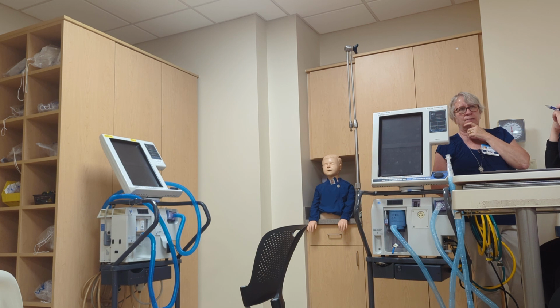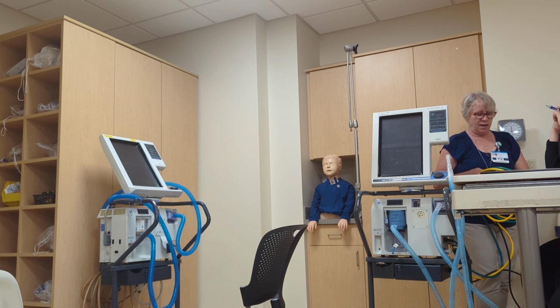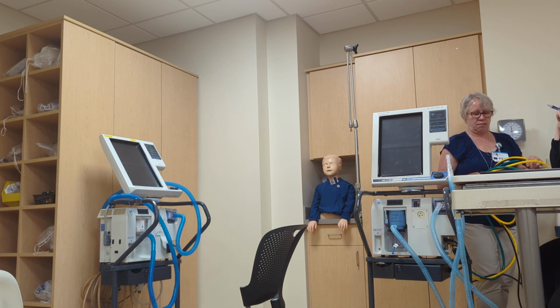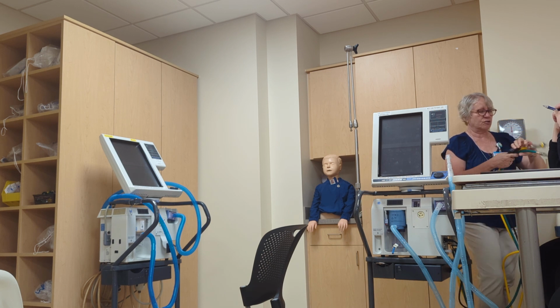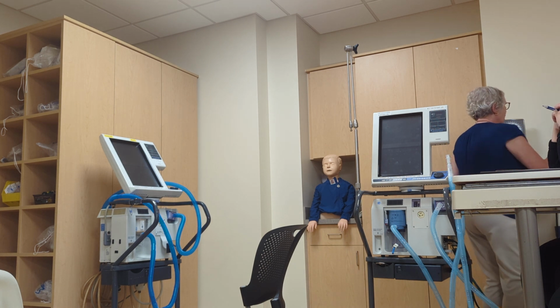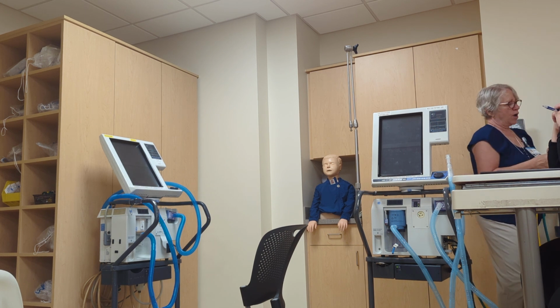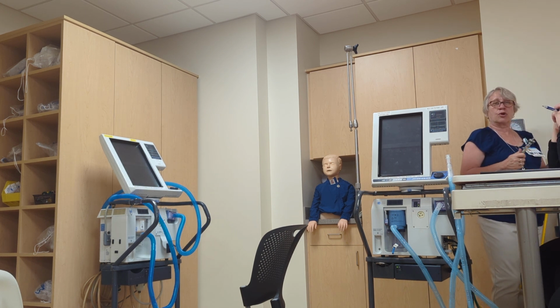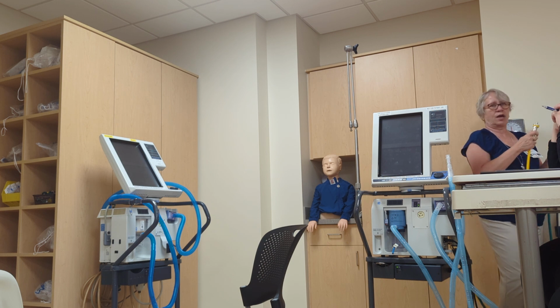Does that make sense? I can turn on my 100% oxygen, which I need, but I just don't have enough pressure, especially if I get multiple ventilators going. But we're going to talk about ESTs and SSTs, and what I want you guys to do is make sure you practice those clinically. Go clean some equipment and do their calibrations, okay?